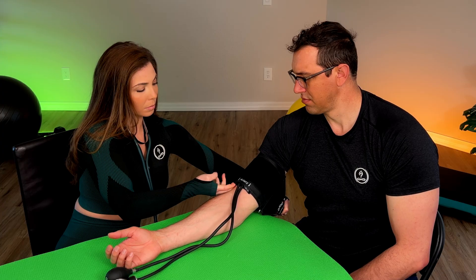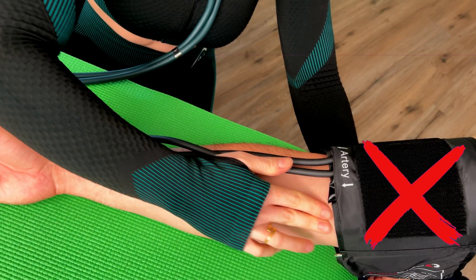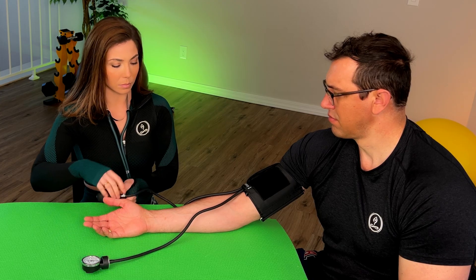Make sure that the cuff is not too tight and not too loose. The perfect degree of tightness before any air has been put in the cuff is if you can wiggle two fingertips into the bottom edge of the cuff, but not be able to slide your fingers all the way. Make sure that the individual has their arm outstretched, palm up, and is relaxed. Make sure their feet are flat on the ground, they're not bracing their calves in the chair, and they're not stooped and hunched forward — their back is securely and comfortably resting against the back of the chair.